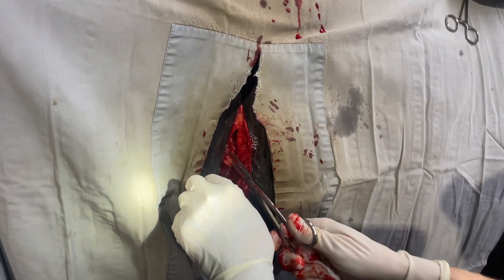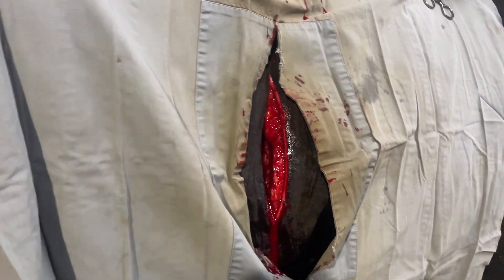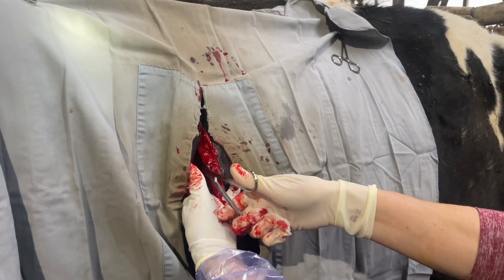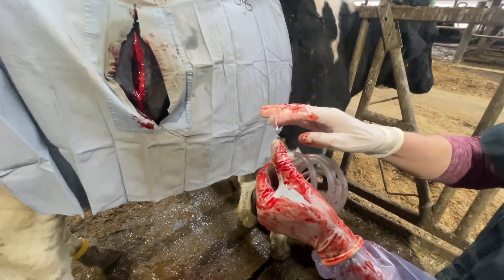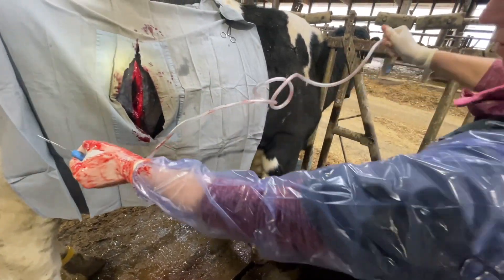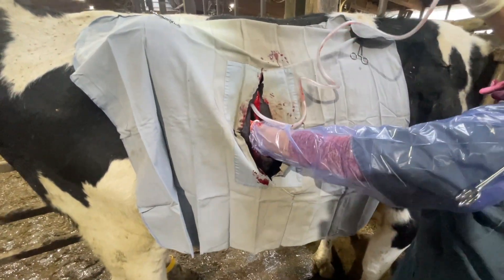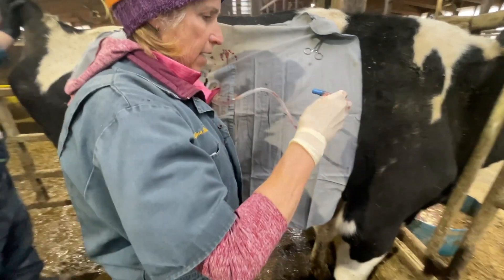You can hear the air going from outside to in. That means there was less pressure inside the cow than out here — that's to allow the diaphragm to function. Pretty cool machine. This is a T-cannula and it's got a nice smooth surface so it won't cut inside of her, but it's got a hole in it. We're going to take this tubing attached to the T-cannula and switch it out. I'm going to protect the end of my finger, put it in her abdomen, and go all the way over to the other side where the abomasum is, and let the gas out this end.